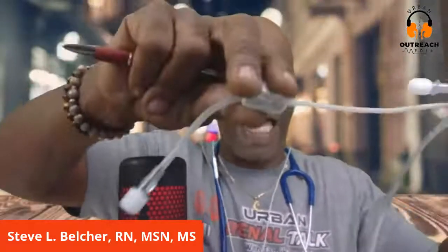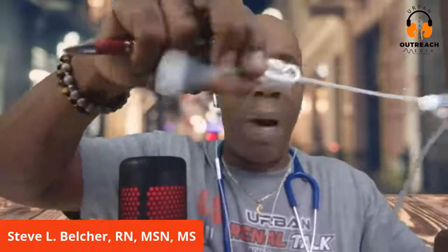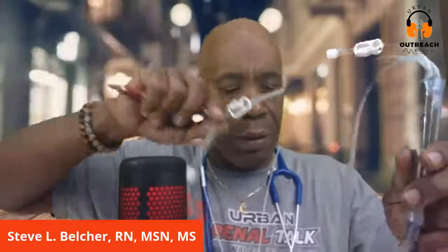So this is the venous line. You want to make sure that when you're on the machine, this line is open so it can monitor your venous pressure. And this is the side port where a lot of the nurses put the medicine in. When you taste that medicine, when they give you the vitamin D or the iron, they put it in this line right here.